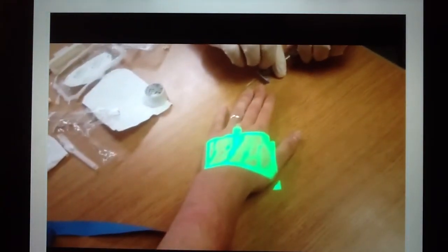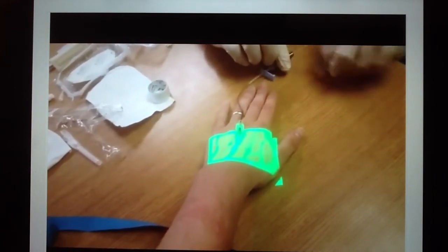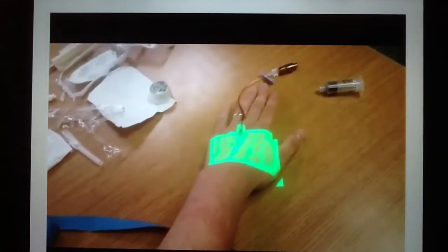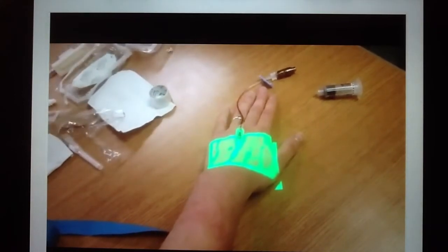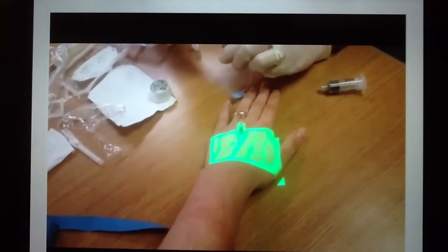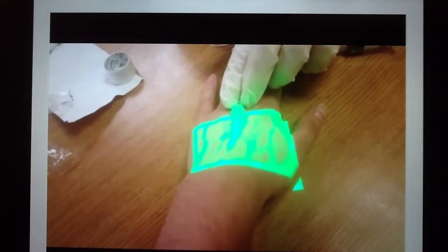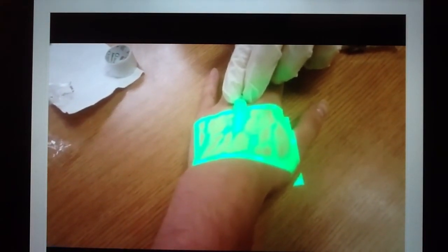After removing the 3 milliliter normal saline, I saw that blood flow occurred through the cannula, which just further demonstrates that there is good patency with intravenous device. I wanted to further check the patency, so I attached a 10 milliliter normal saline syringe to the end of the hub and flushed. If you look closely, you will see the near-infrared light disappears at the top of the patient's wrist, which just further demonstrates good patency.